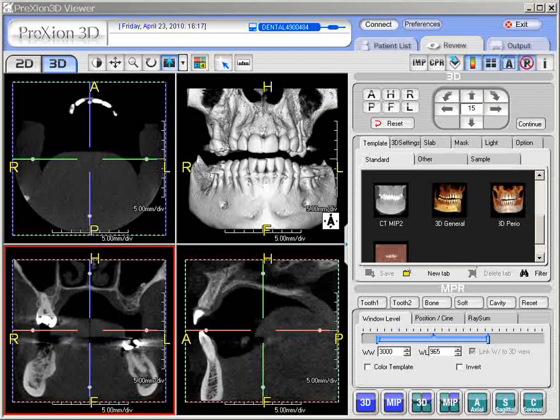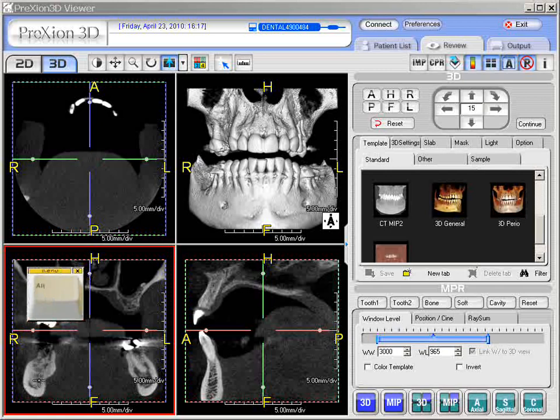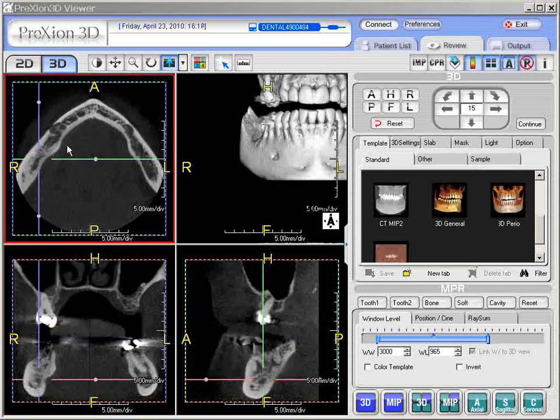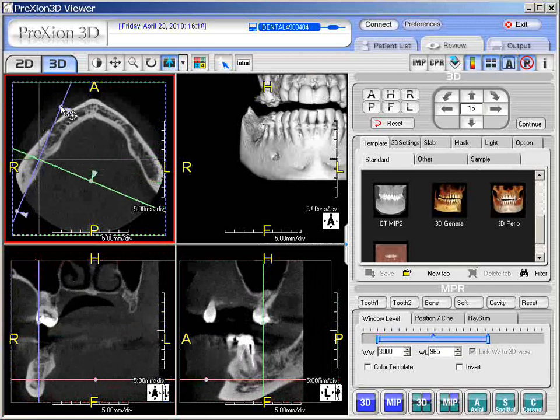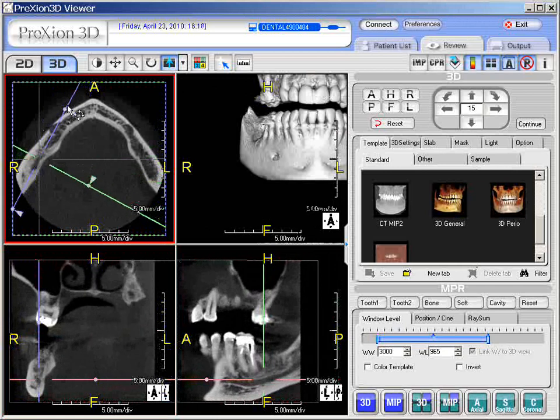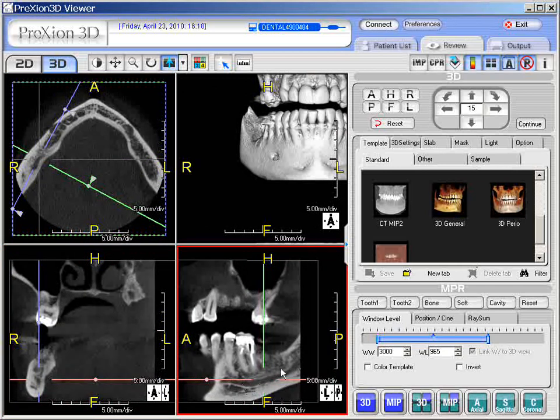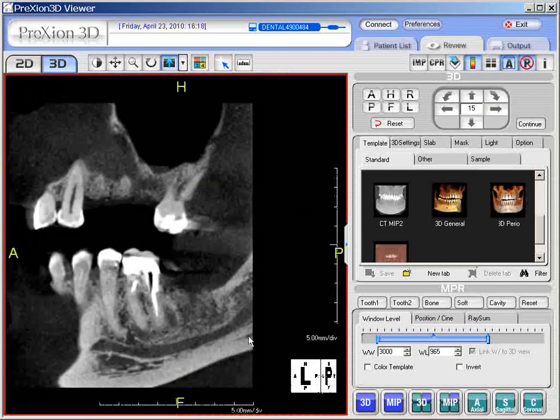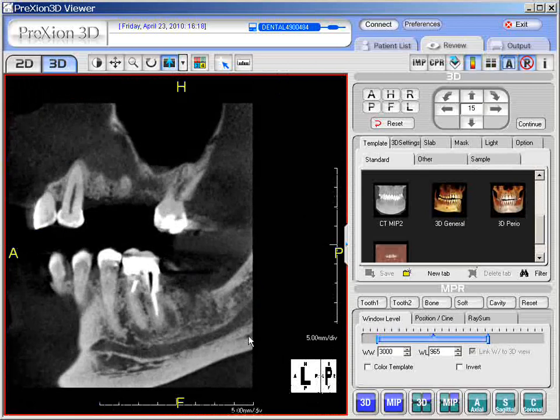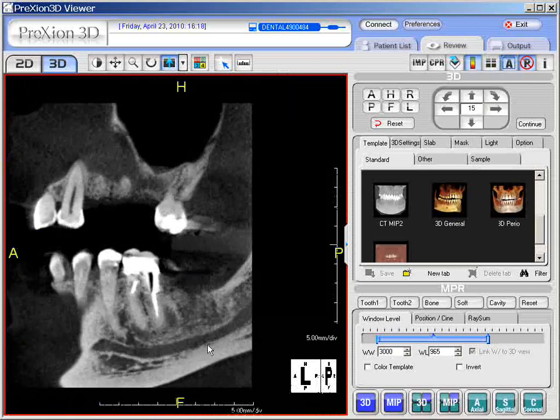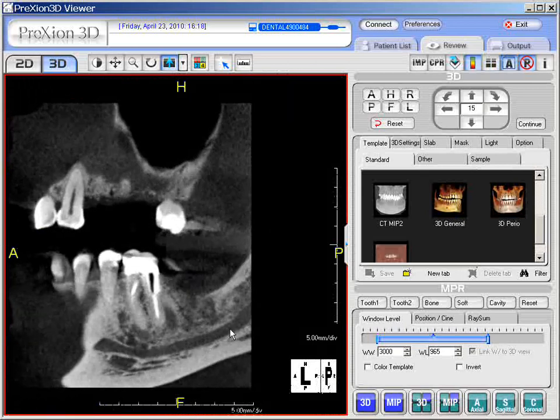This works particularly well when evaluating the mandibular canal. Once the canal is identified, press the ALT key — you'll get the caliper. Click right into the mandibular canal, left-click it, release the ALT key, go back up to the anchor point, and swivel. If you look in the sagittal plane, you have a nice, clear depiction of the mandibular canal. Double-click it and slice to examine the mandibular canal.